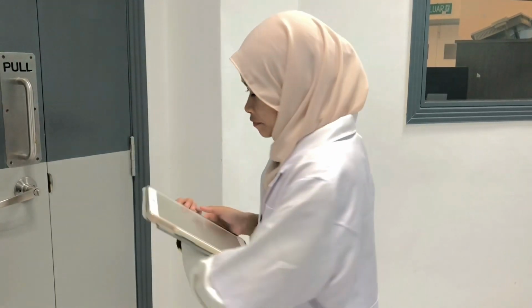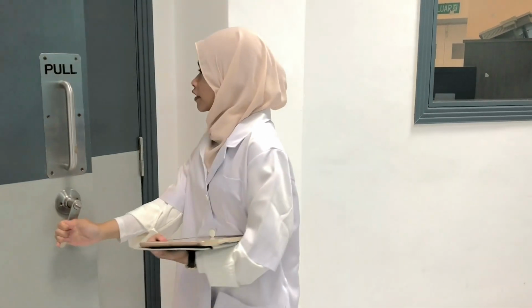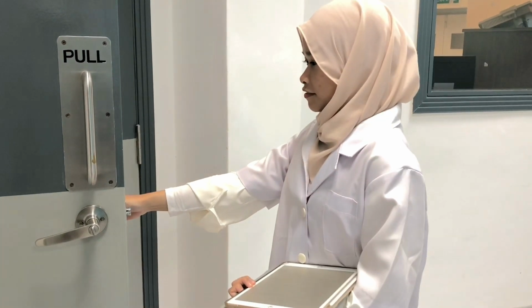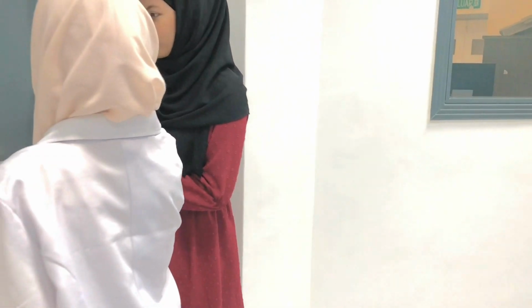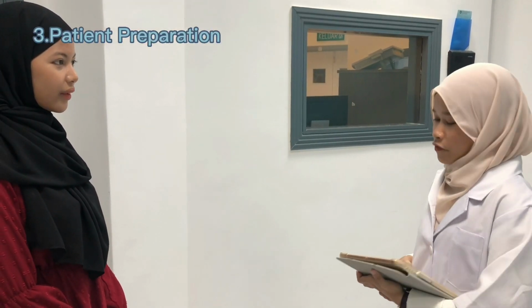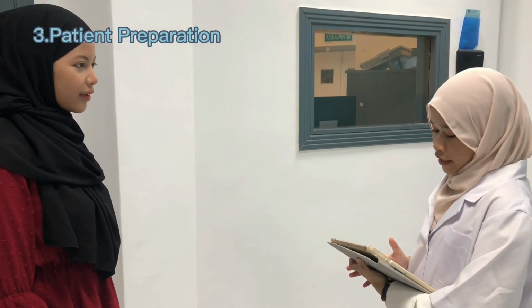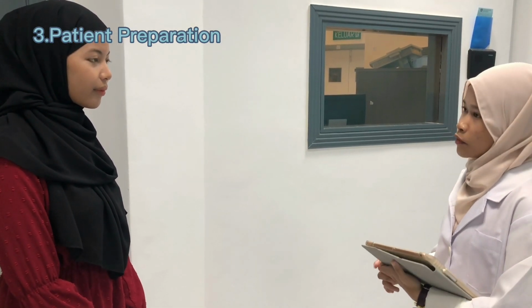Everything is set up, so I will call the patient to come in. Hi, I'll be your radiographer for today, and we are going to do an AP open mouth projection. May I know your full name and your ID number? My name is Natasha. My ID number is 041011030338. When is your last period cycle? One week ago.